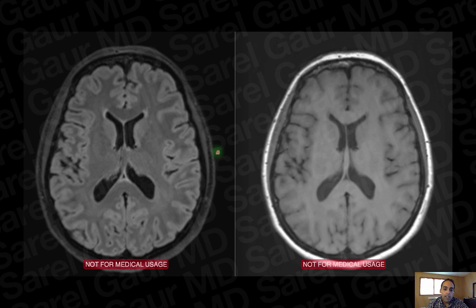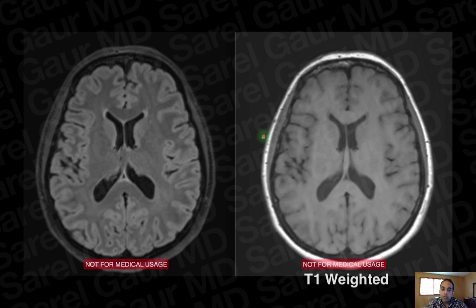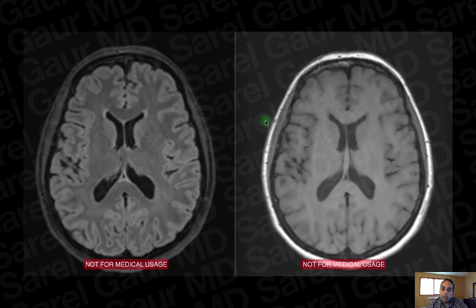Here on the left I have one of the most important sequences in brain imaging — the FLAIR sequence — and on the right I have the T1 sequence. Initially at first glance they might seem like the same sequence, but you can see that on both the ventricles are dark and the fluid in the subarachnoid space is also dark.